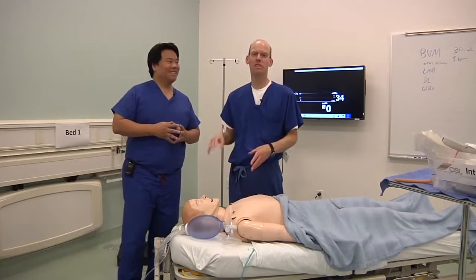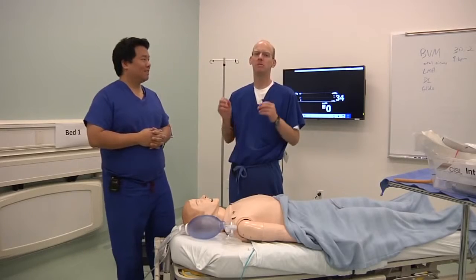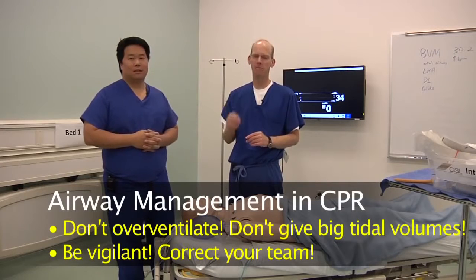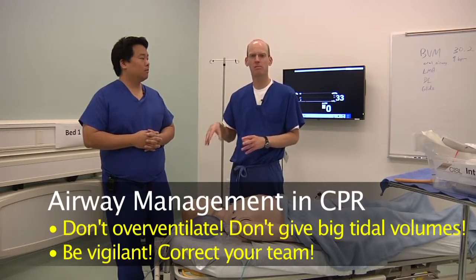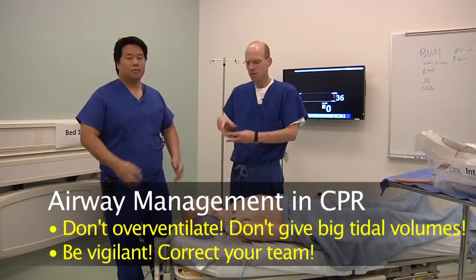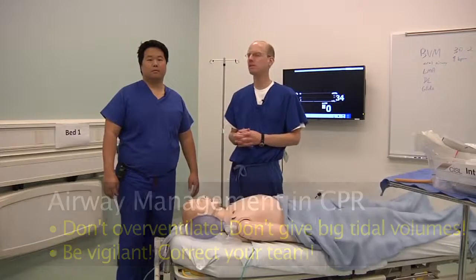You can't squeeze an ambu bag any faster. Trust me, this is something that's going to happen. People are going to overventilate. You have to watch for it. You have to correct your team. And you've got to make sure they don't give big tidal breaths, because you may get them slowed down, but then they're going to just give these big tidal breaths. It's little puffs, just to get some oxygen into the patient.